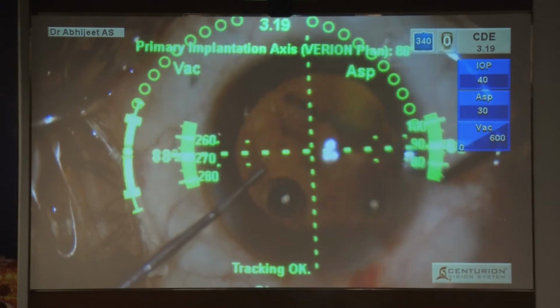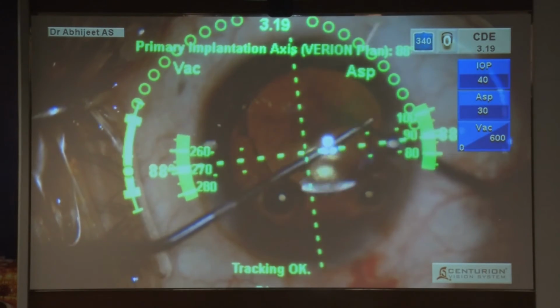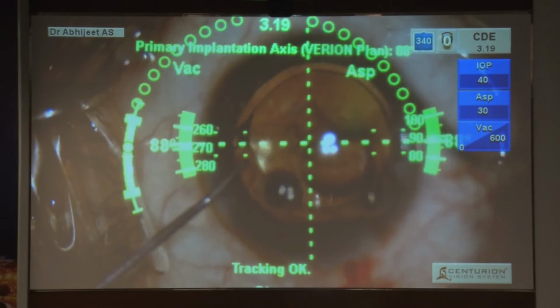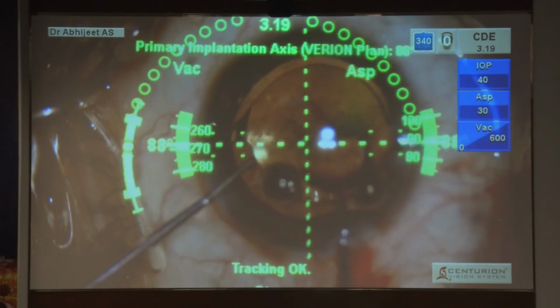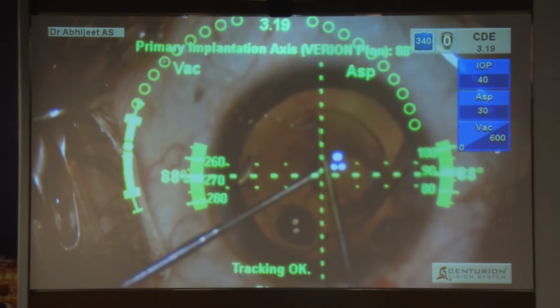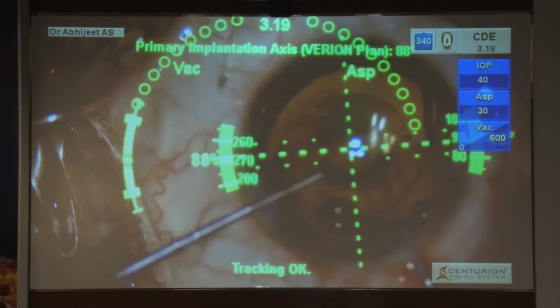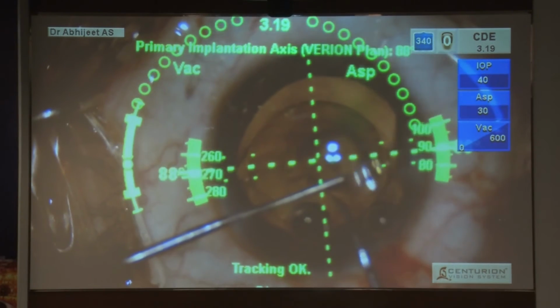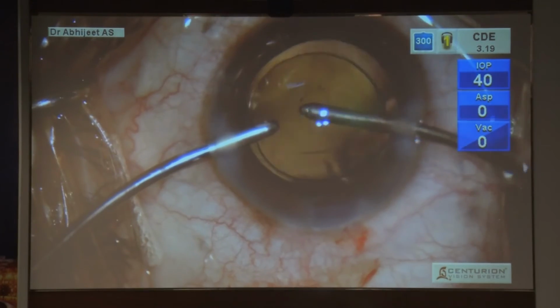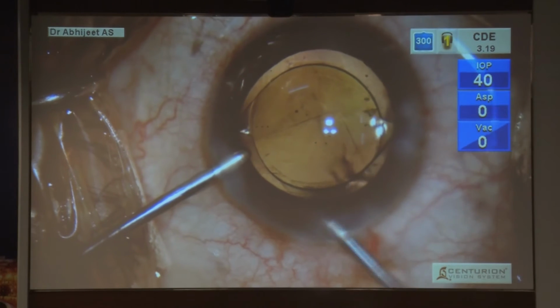So now once I'm sure that that area in which the haptic has gone is the area where the equator is, now I have shifted the entire IOL into the axis. So the important part is the knuckle should go into the equator because there still is some support out there, and you want the haptic to be there and the optic to be held in front of the rhexis anyway. And it's perfectly sitting well, stable. Tap on it, see, do the trampoline test.